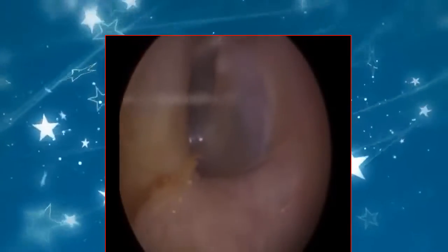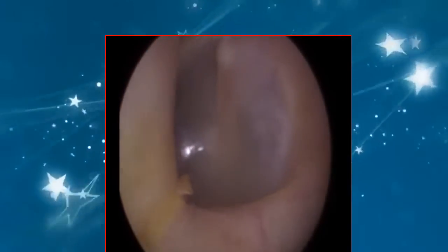We have here an elderly client. He was very anxious, very nervous upon attending. It's the first time he's had his ears removed, quite fidgety, so I had to really relax him prior to starting the procedure. Starting off with the right ear, you can see the wax is very hard, very dry. It's obviously been there for many, many years. It's oxidized, turning from a pale brown colour to a very dark brown shade.